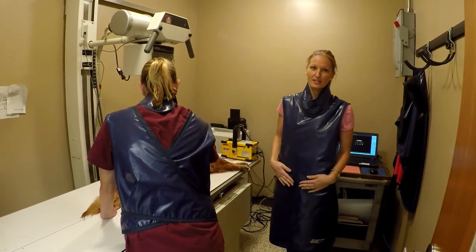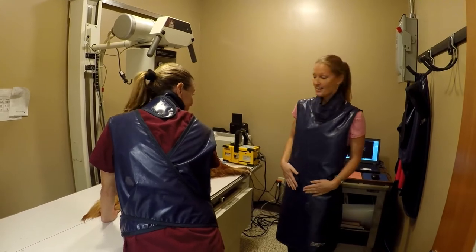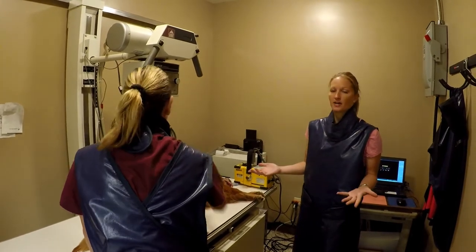Welcome to the x-ray room here at Baldwin Animal Clinic. I'm Dr. Davis and this is Jen, our technician. We're going to take some x-rays of Lacey's hips — basically arthritis x-rays.